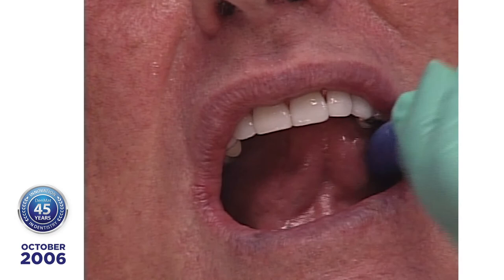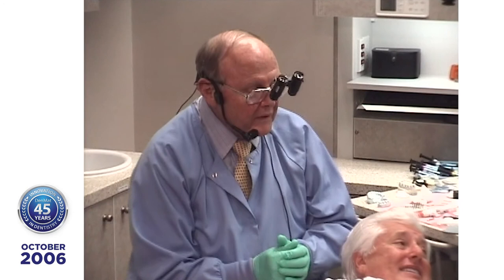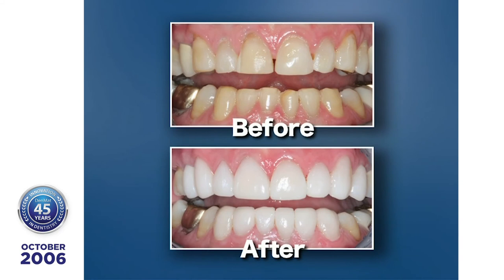Now, this has been about 2 hours, and tomorrow we'll open his contacts, do some more finishing, do some more final occlusal adjustment. And we transformed this patient with 14 Lumineers in 2 hours. So with that, I'd like to tell you it's been fun being with you. Remember, I've got Lumineers, and I tell people if I could get hair the way I got Lumineers, you'd call me Curly. Okay.